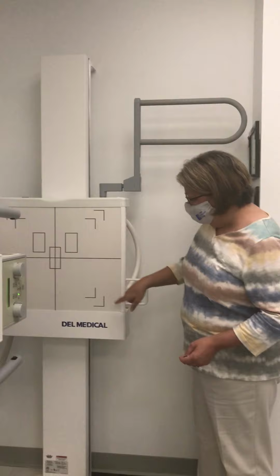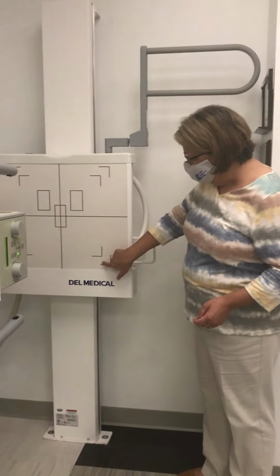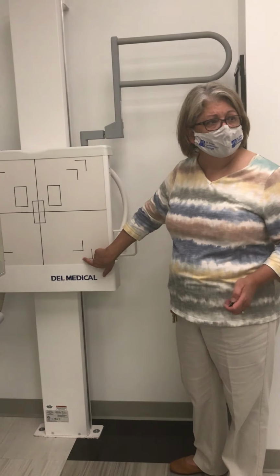Next, we're going to place our marker before our patient gets positioned. And it doesn't matter if this light is on or where this wall bucky is positioned. You'll know where to place your marker because just like on the KUB, we're going to place the marker at the inferior outer corner.